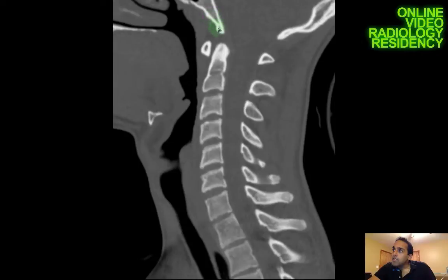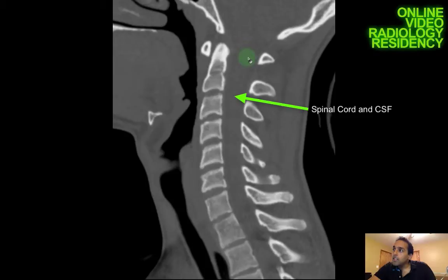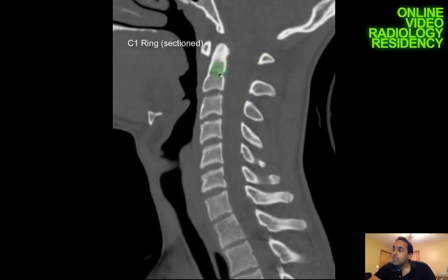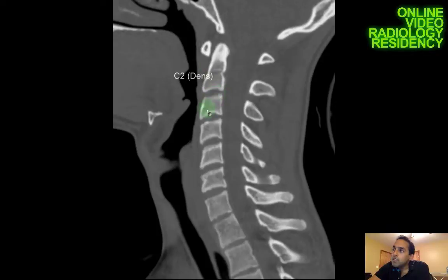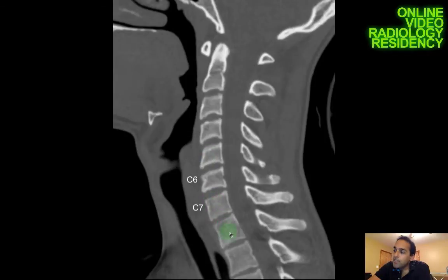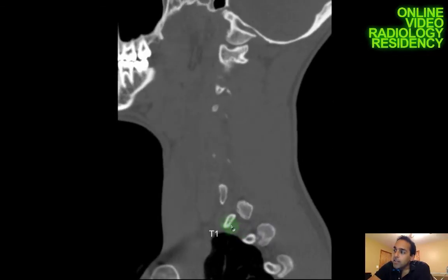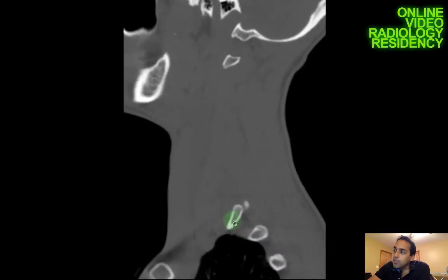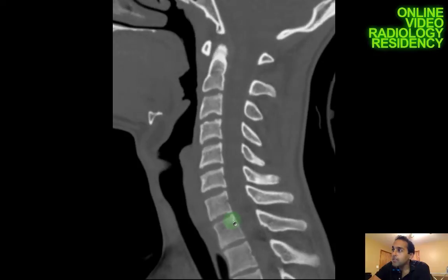Looking at the bony anatomy, I can see the foramen magnum, and the cervical spinal cord comes through here. I can see the C1 ring, C2, the dens of C2, and the vertebral bodies C3 through C7. Coming out laterally I can see the rib associated with it, so I know I'm in the thoracic spine at that level.